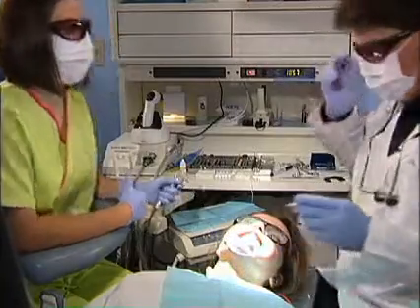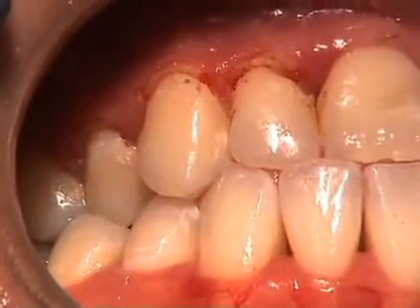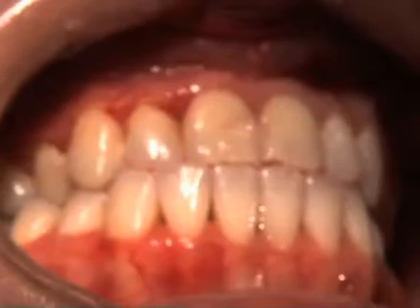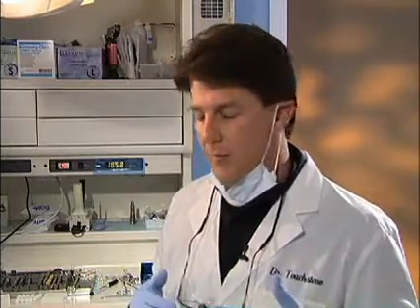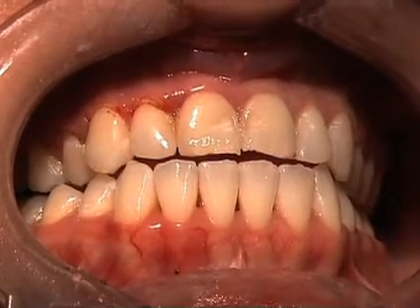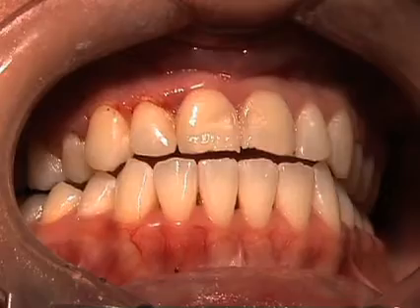That's all we need to do with that. Now we've got nice symmetry as far as the tissue is concerned — crown lengths are very similar to one another — and we're ready to move forward with the preps. It's important to note that in the diagnostic phase, we had determined that the tooth length we're going to create for Tarina will be correct in terms of phonetics and function. That was done previously with a template provisional over her unprepped teeth. Now we've achieved proper symmetry with the tissue and will establish proper tooth length using the template from the diagnostic wax-up.